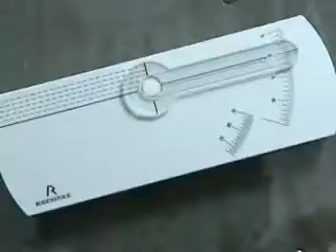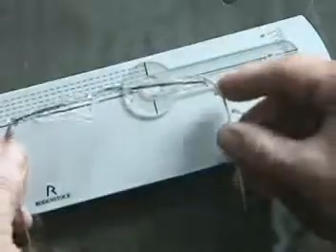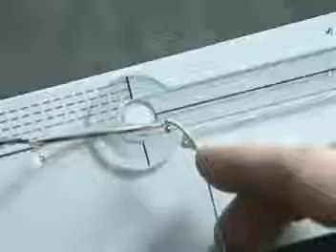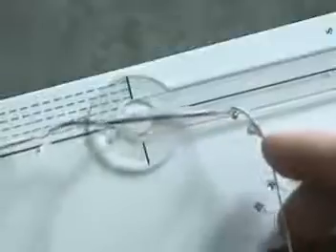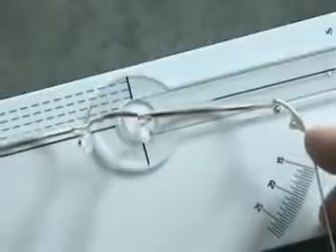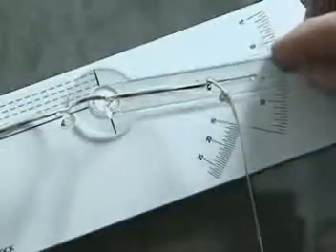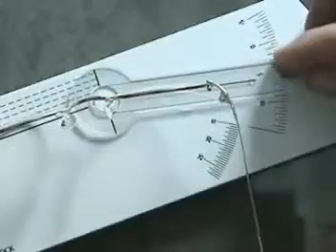The final value is the bow of the frame, the dihedral angle. Rodenstock can provide you with a further measuring tool for the exact determination of this value. The measurement takes just a few moments with this. Position the left eye shape parallel to one of the fitting lines. And center the nasal edge of the right eye shape over the point of rotation of the measuring pointer. Align the pointer parallel to this frame half. Now just read off the value for the dihedral angle.